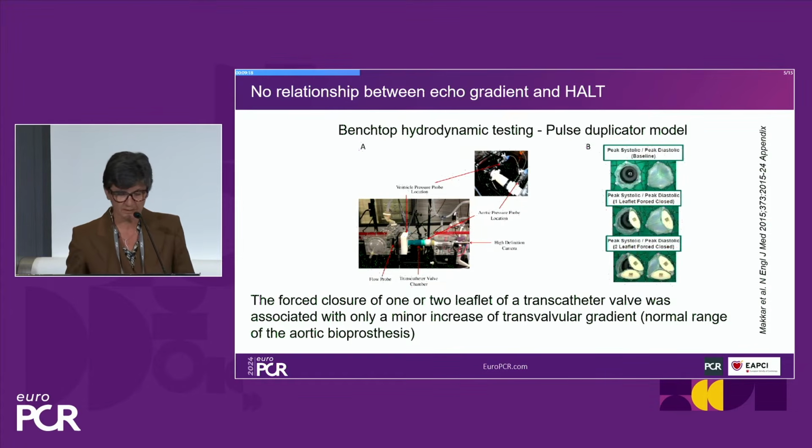And as mentioned by Christian, especially in large anatomy, large annulus, it will be associated with only a minor increase of transvalvular gradient, which can still stay in the normal range of the aortic bioprosthesis. So this is the reason why we can underdiagnose the HALT phenomenon using only the echo follow-up.